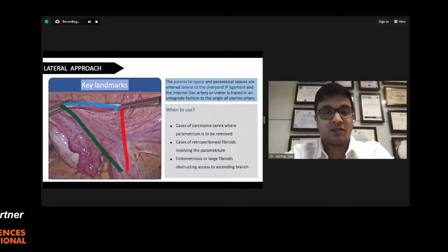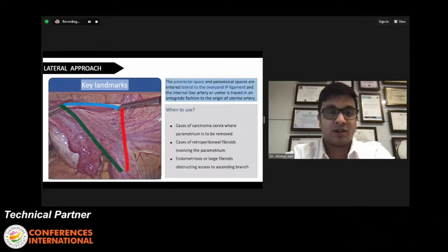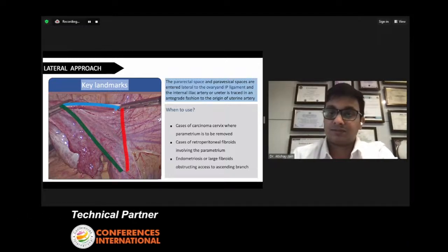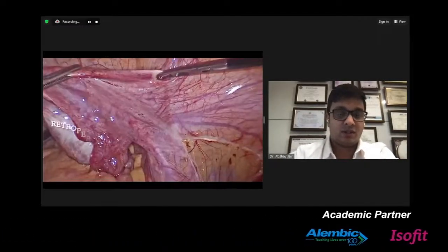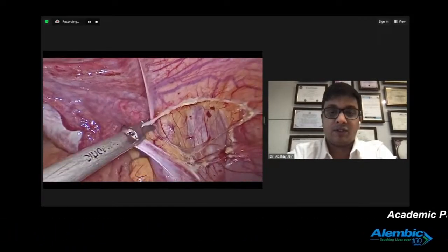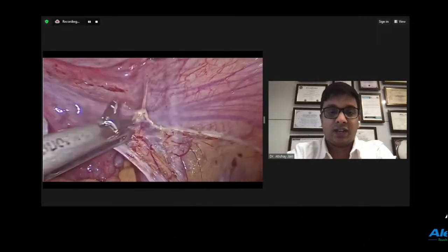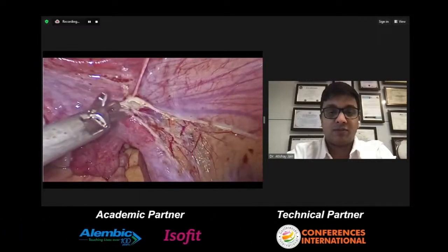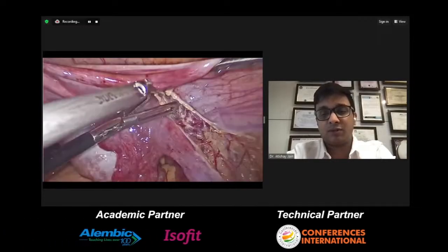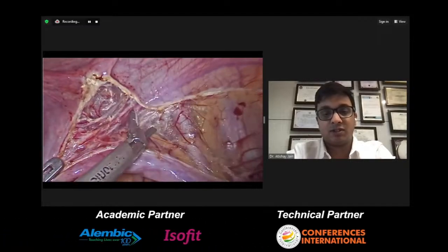In this approach, we enter the retroperitoneum by marking an imaginary triangle between the round ligament, the IP ligament, and the shadow of the external iliac. And this is how we do it. We can either start from the top or below, and then we go layer by layer. Firstly, we cut the peritoneum, and I'm using the ultrasonic scalpel, the harmonic, over here. We can either cut the round ligament or leave it. It depends on which surgery we are doing.